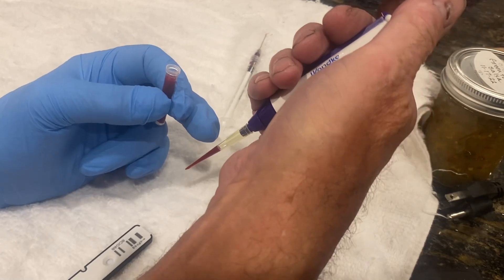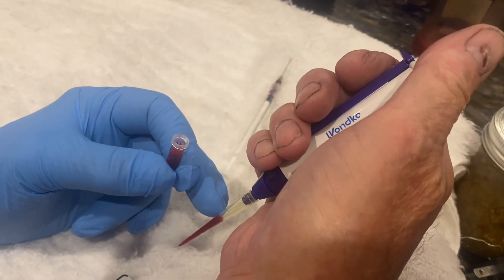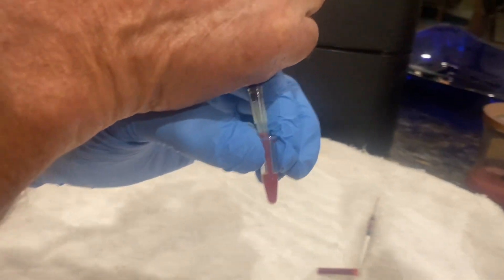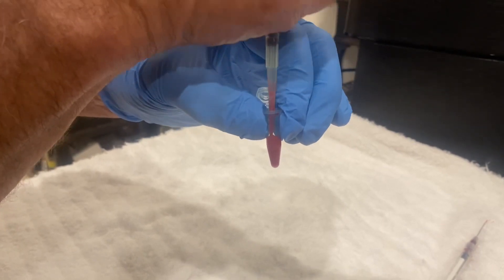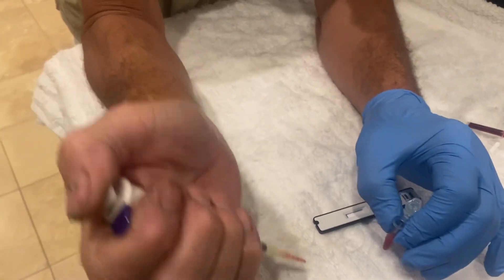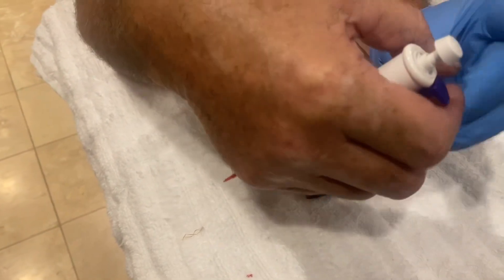Go halfway down, into the blood, let it go, and it'll come up to the first line. It comes to the same place every time. This cartridge comes with some fluid in it — you get one for every test and throw it away afterwards. Put this blood into the fluid, then move your finger up and down to suck it in and out, really mixing it up thoroughly. Then using the same halfway-position technique on the auto-pipette, go into the mix, let it go, and it'll come up to the same level. Close it up, and that goes to the window.